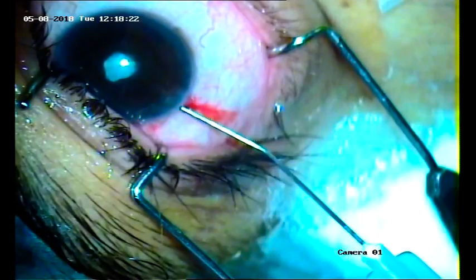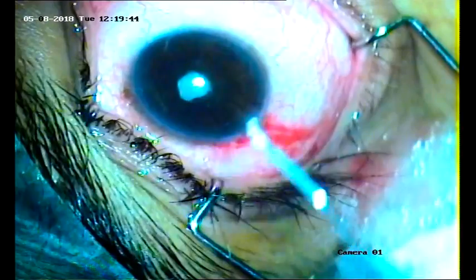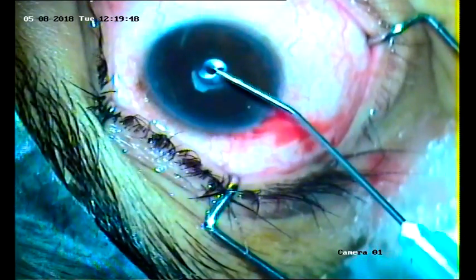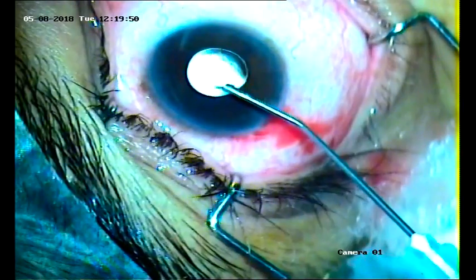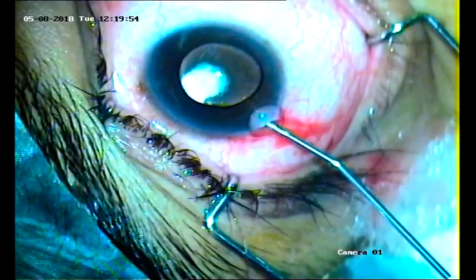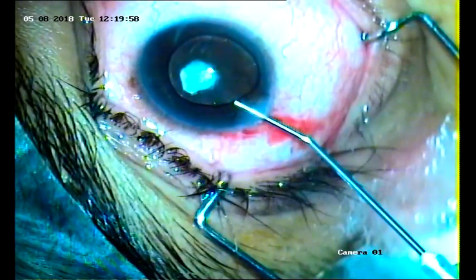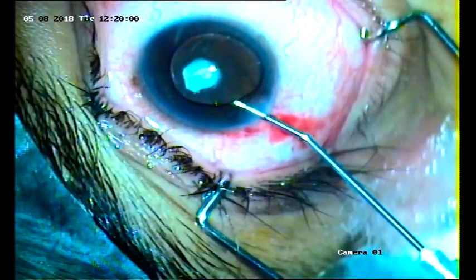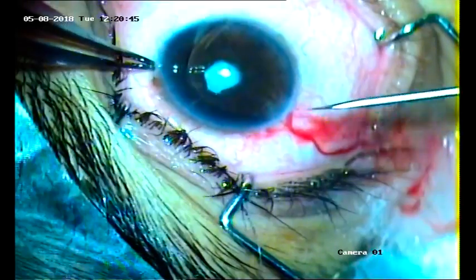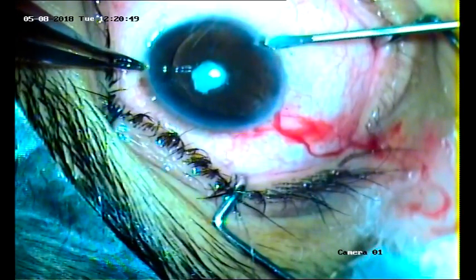This is a 2.8mm clear corneal incision. High molecular weight viscoelastic is utilized to maintain the anterior chamber, having good depth of the anterior chamber and to dilate the pupil as much as possible. This is the side port incision — two side ports, 180 degrees apart.